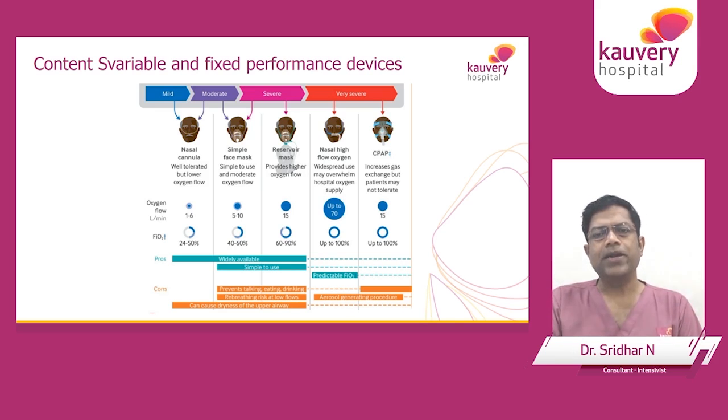Now, despite the patient being on HFNC, despite the patient being on non-rebreathing mask, if they continue to desaturate, now my go-to device is I bypass the HFNC and go to a CPAP device. So if you have a dedicated CPAP device with a well-fitting mask, then this is what we can use. If you have a device that provides BiPAP, then we can continue to provide PEEP. Please put your IPAP or pressure support, whichever mode you're using, at 0, so patient only gets CPAP. Now in CPAP devices, we can still continue to provide 100% oxygen through an appropriately fitting mask.